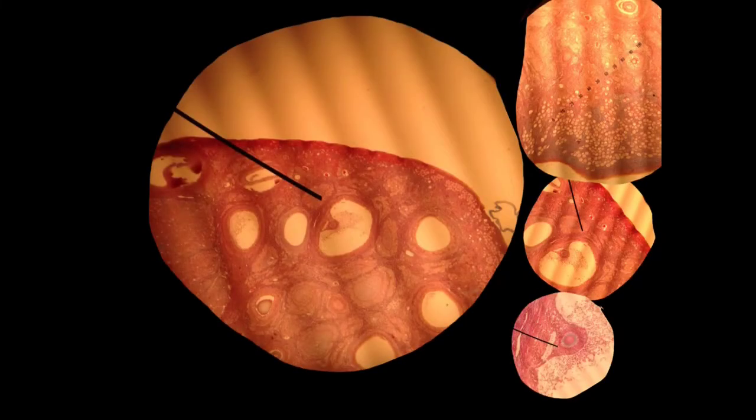Alright, we're just going to walk through ovary histology real quickly. Luckily this week your slides are really excellent in the ovary, so you can actually see a lot in any particular ovary slide. This ovary slide is actually the corpus luteum ovary slide, and you can see just an edge of it right here. That comes after ovulation.